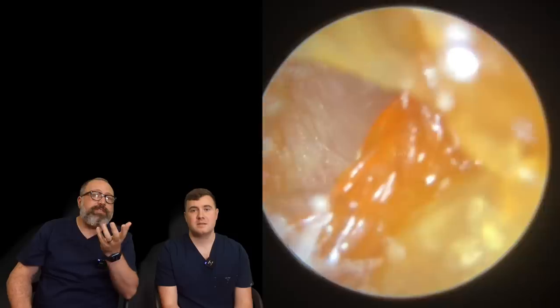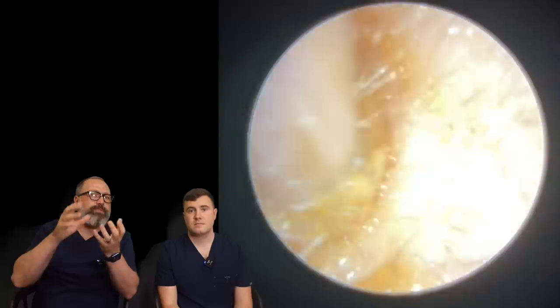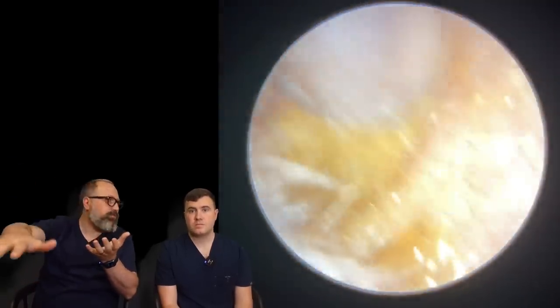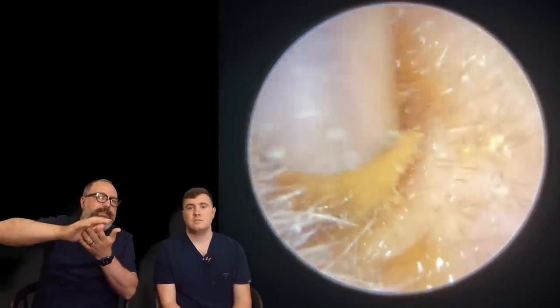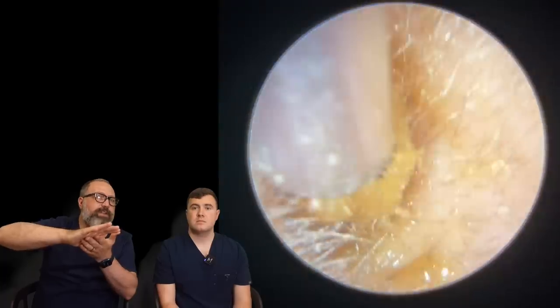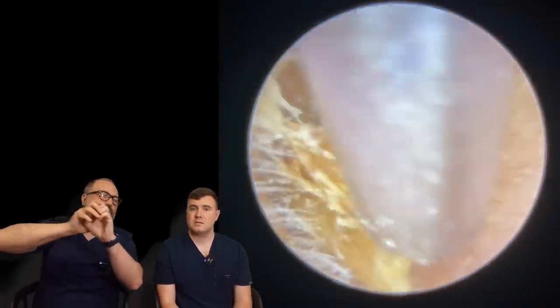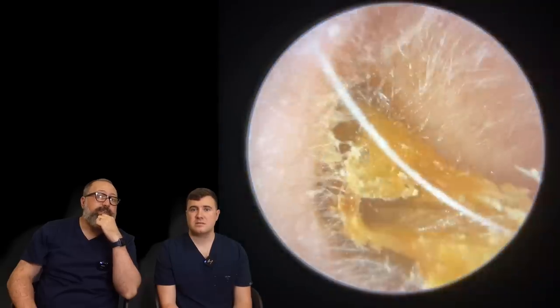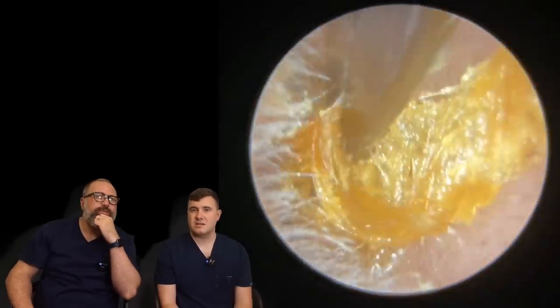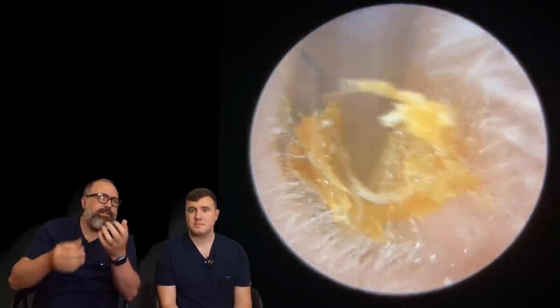So this is my patient again now — you can see it's very different. We can see the hole there straight away, so this ear canal is not completely blocked, but this is all skin. We talk about skin migration coming out of the ear canal to the lateral portion and breaking away. This particular patient suffers a little with the skin getting to that outer section, migrating out really well but then just not breaking away. What you end up with is it coming out of the canal, folding down over itself — almost like a shell. It sort of peels away like a sleeve of dead skin, really.